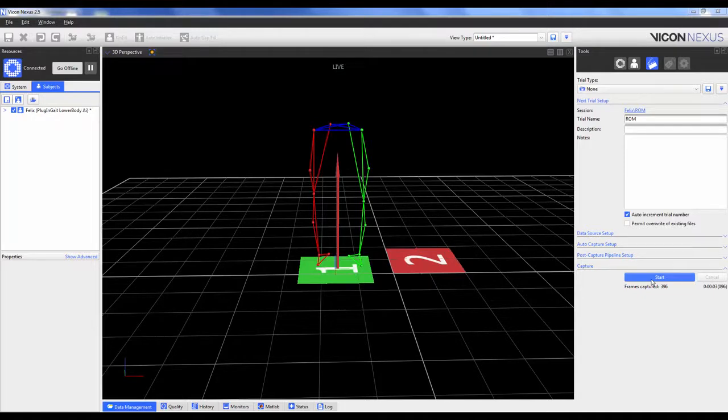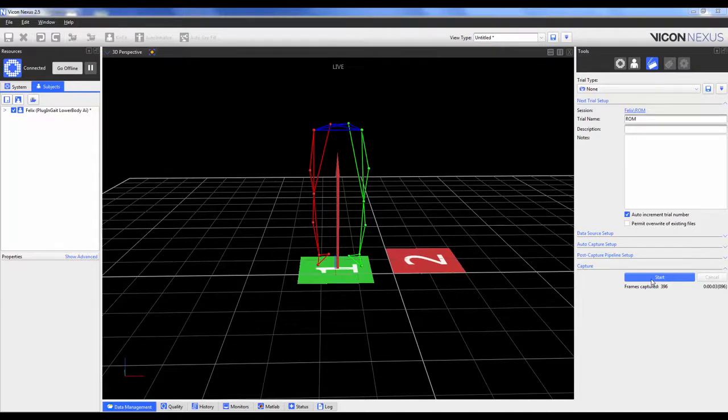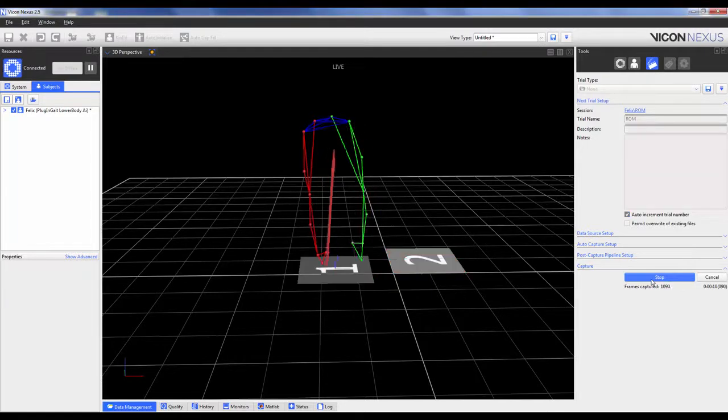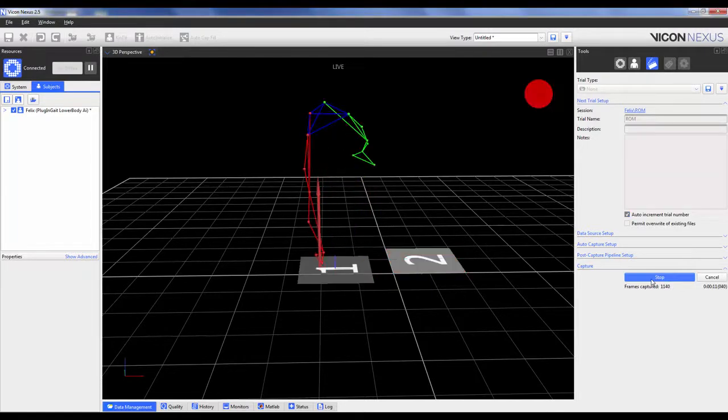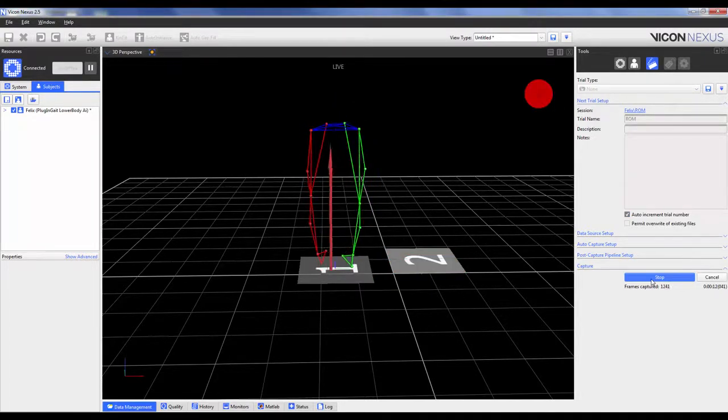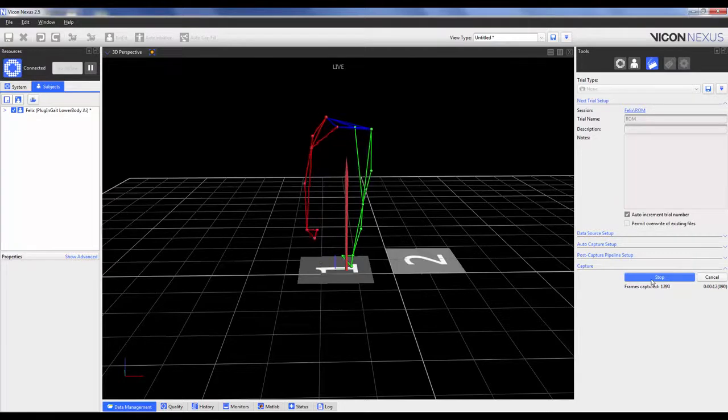While you could use a dynamic trial as the ROM, it is probably best if the subject can perform a series of movements in the middle of the capture volume that can meet the joint range and velocity requirements. For example, if we were analyzing a counter-movement jump, the ROM may look something like this.